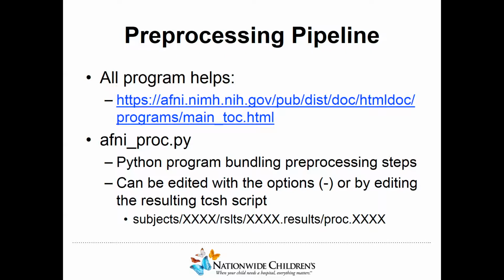There are a couple of things that I think are really helpful within the paradigm that we're using. And while AFNI as a program can get a little complicated sometimes, their documentation system is really good.